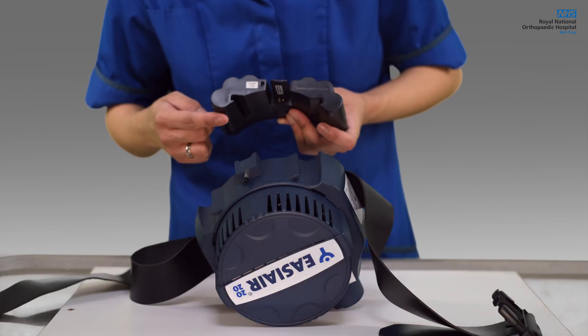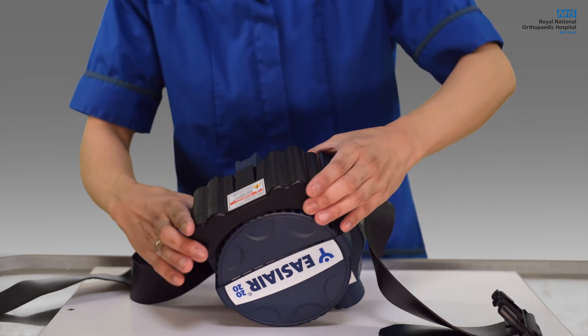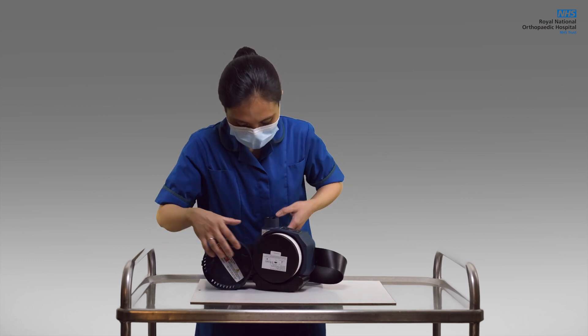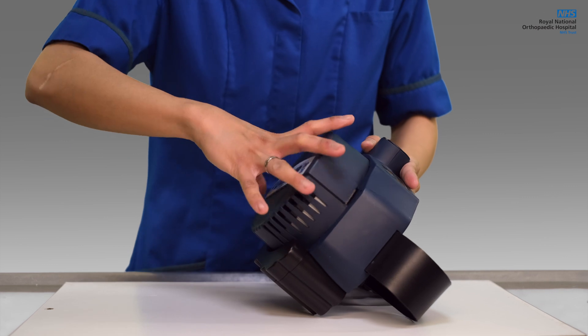Insert the battery by aligning the curve of the battery to the bottom of the unit. Push down and you will hear a clicking sound if this is done properly. To insert a filter, simply put on top and push gently. Take the splash guard and align the arrows to the lock sticker. Push gently, then seal by rolling the splash guard clockwise.